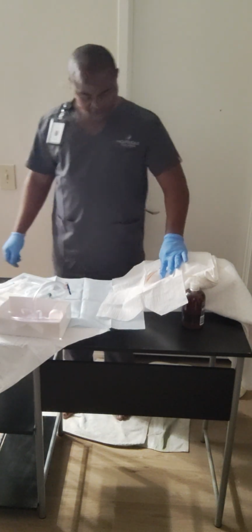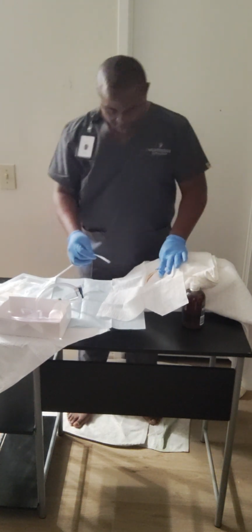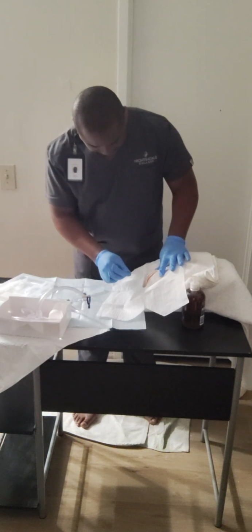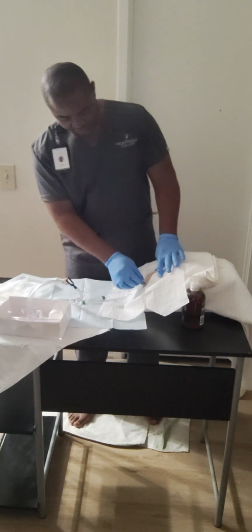Now that I've cleaned my patient, I will go ahead and get the tip of the catheter. I'm going to insert it about 3 to 4 inches into the patient until I see urine. Okay, there goes the urine.